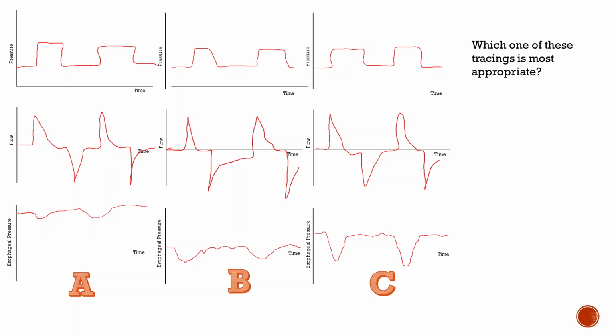There's two things you can do with it in these ARDS patients that's more important. You can help decide what your true plateau pressure is, right? Because we're worried that our patients with ARDS have all these chest wall compliance problems, obesity and abdominal distension, and a falsely elevated plateau pressure. If you get rid of what's outside the lungs and figure out what's actually in the lungs, we can guide our ventilator management better. This would pertain to either your tidal volumes if you're using volume control or your peak pressures if you're using pressure control.